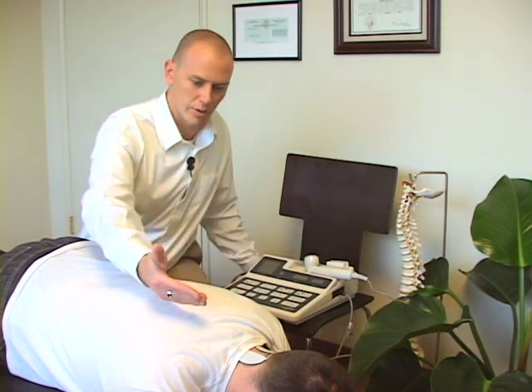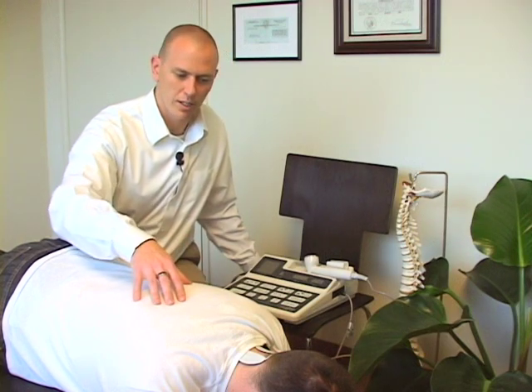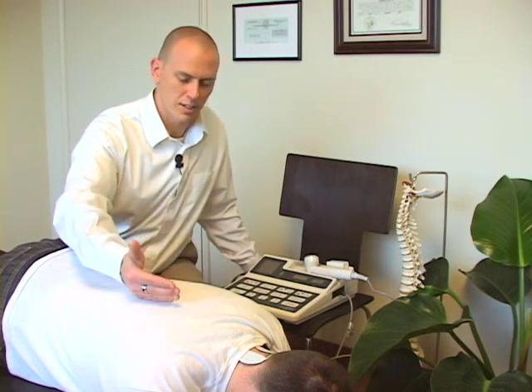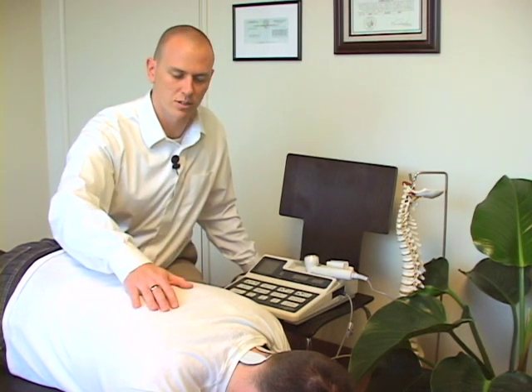The system goes on, we turn the current up, and the current is going to go through there for about 10 minutes, give or take. The job of the EMS is basically to promote more of a muscle relaxation. Additionally, if there are people that are in acute levels of pain and there's inflammation around the areas, it helps to flush some of those inflammatory toxins out as well.